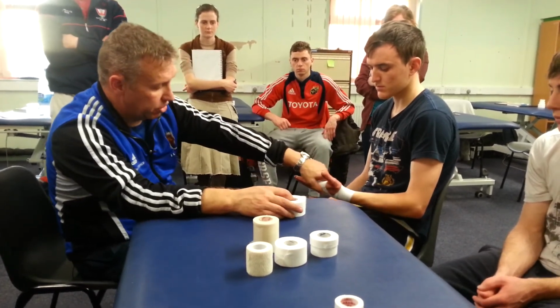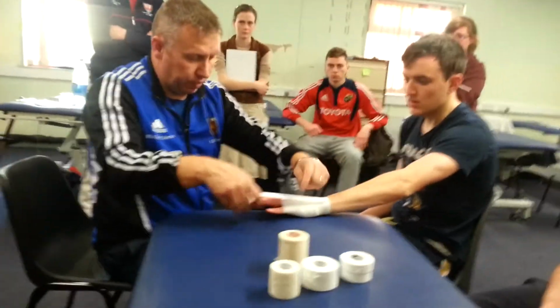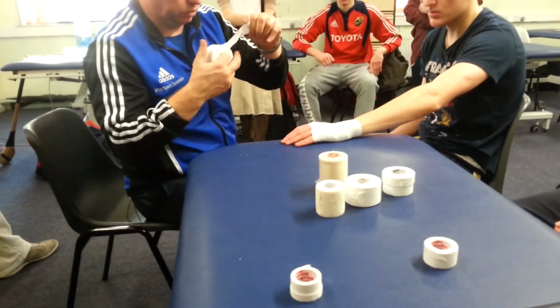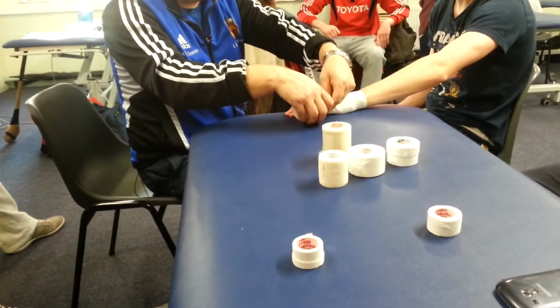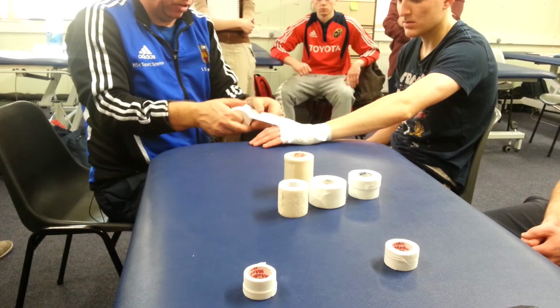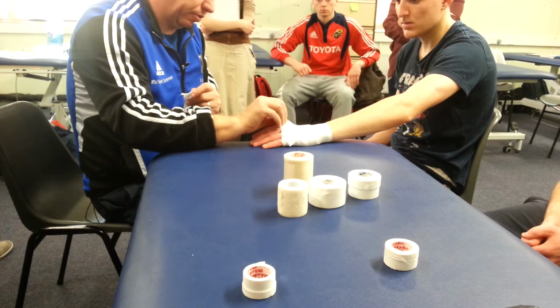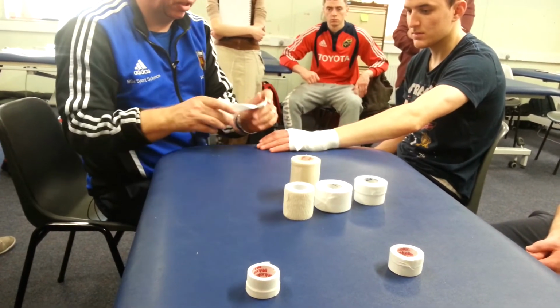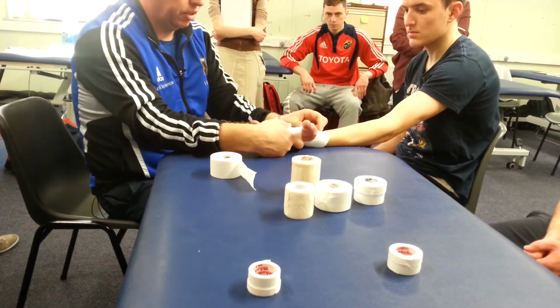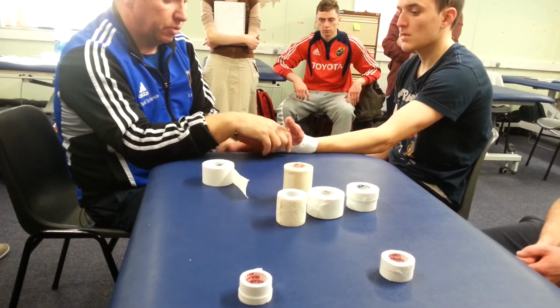But you can do different variations, as I said. If you want to block flexion, then you can do your block from anchor to anchor, just a check rein type scenario, and then re-anchor that. So if you want to increase the effect, and block the wrist into flexion so the person cannot flex, anchor that, and that's going to stop flexion, or vice versa. You can do check reins here, and it's going to stop extension. And that's really the wrist.